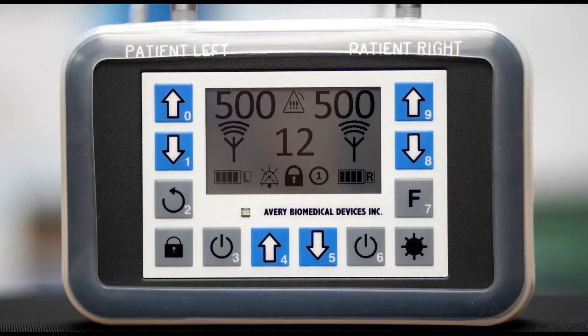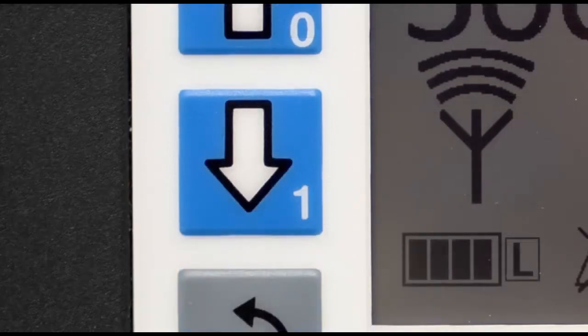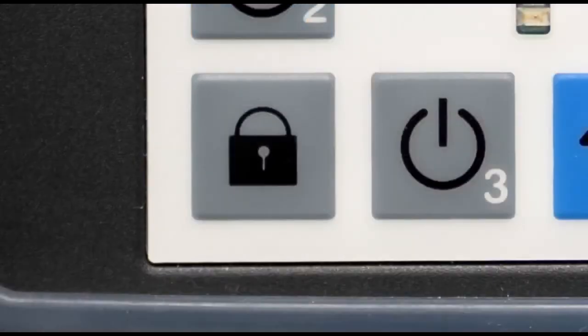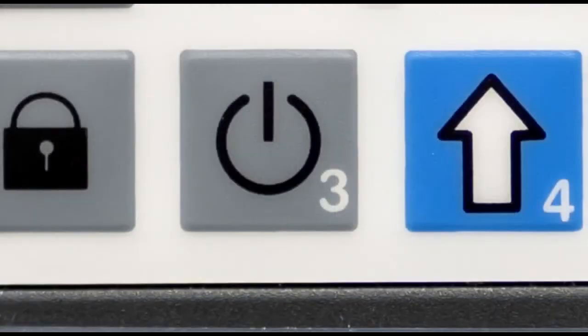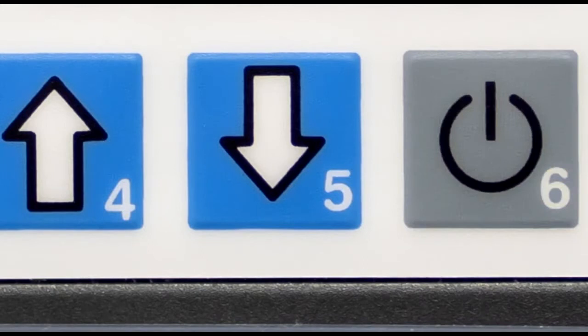The following are the keys. Key 0 increases the left side amplitude. Key 1 decreases the left side amplitude. Key 2 is for Avery Technician use only. The lock key locks and unlocks the keypad. Key 3, when pressed and held for 2 seconds, turns the left side output on or off. Key 4 increases the respiratory rate. Key 5 decreases the respiratory rate.